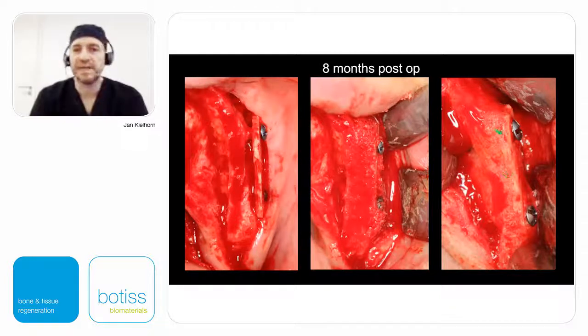You see here exactly how nice the bone heals. You see nearly no difference between the gap bone and the plate. It's disappearing, it's rounding, and you see that the screws are still in shape, so there's no resorption taking place. So there's a slower turnover, of course, of allograft particles, which here seems to be of an advantage, because if there's a slower turnover, it means there's more stability and there's less resorption. And in the outside cortical plate, we don't need vitality and resorption, we need stability. In the inside, that's where we need vitality and turnover.